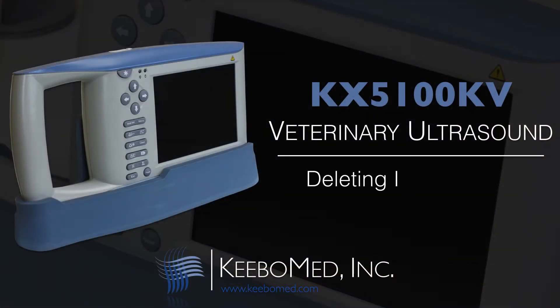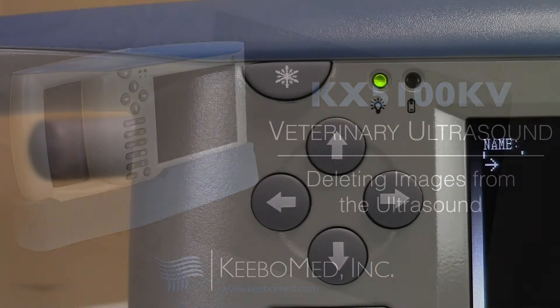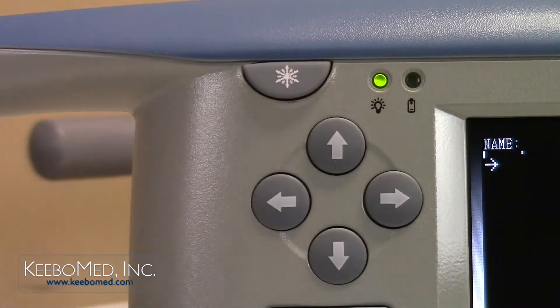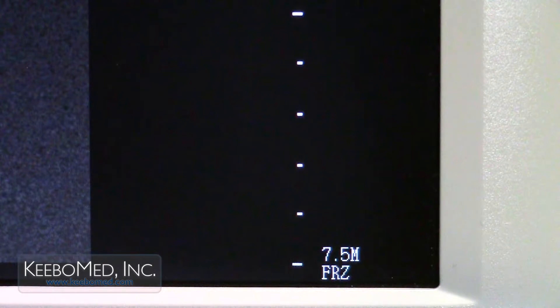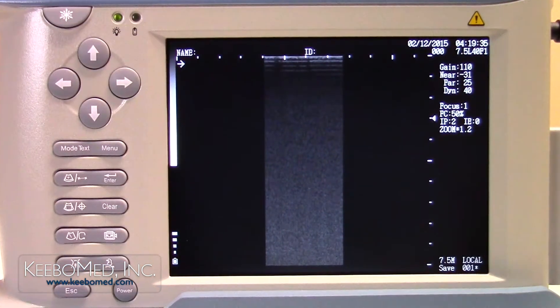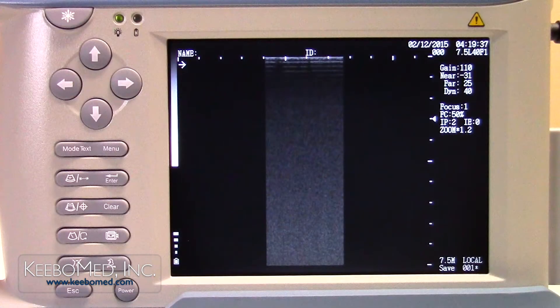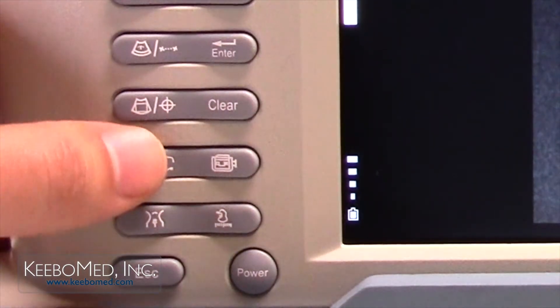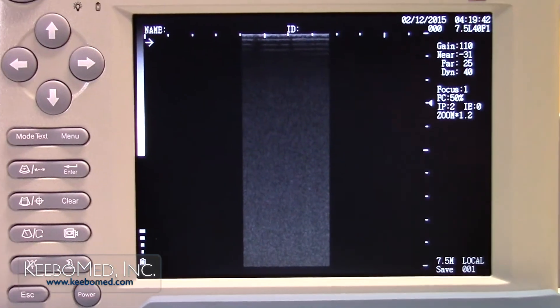If images need to be deleted from the ultrasound, follow this procedure. Step 1. Press the freeze key to freeze the image. The letters FRZ will appear on the bottom right corner of the screen. Step 2. Press the save key to recall the saved images on the system. Step 3. Once the proper image code is selected, press the delete key. The asterisk will disappear indicating that the image is now deleted.